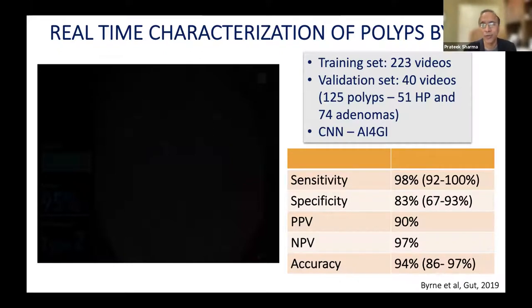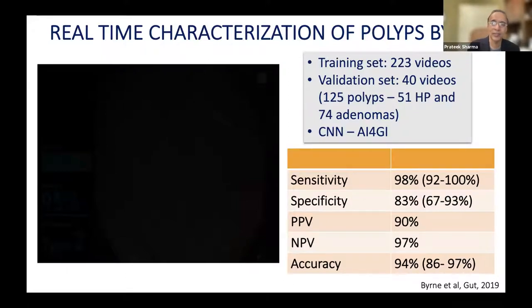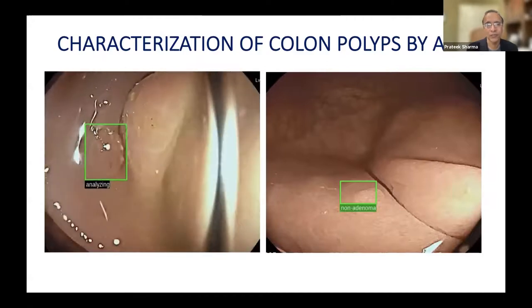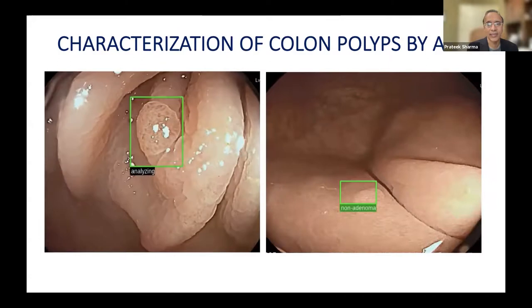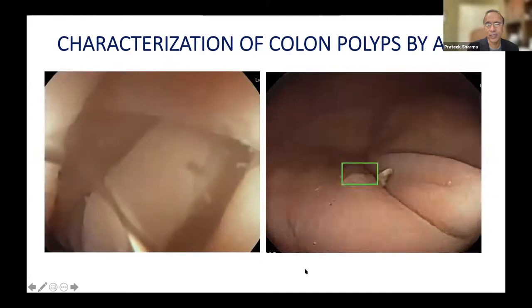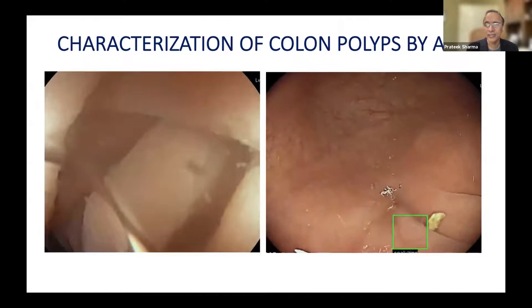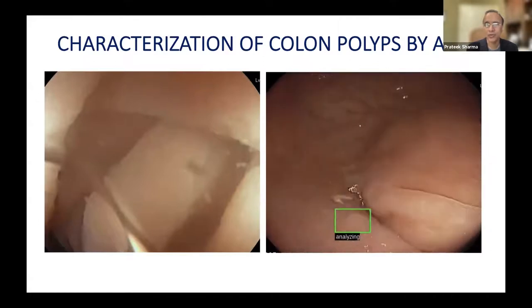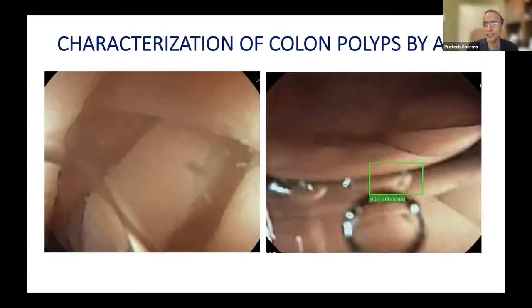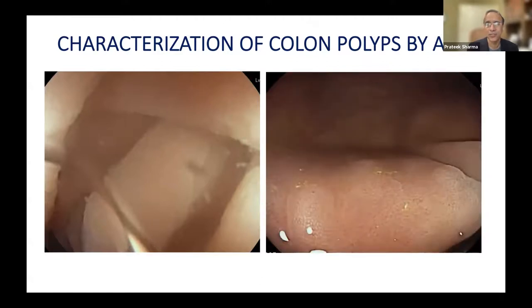Another similar example shows a device analyzing a lesion and calling it an adenoma. Then on the right, it looks at a similar lesion, starts analyzing it, and predicts its histology — in this case recognizing it as hyperplastic or non-adenomatous tissue. That is the characterization part of these CAD-X devices.